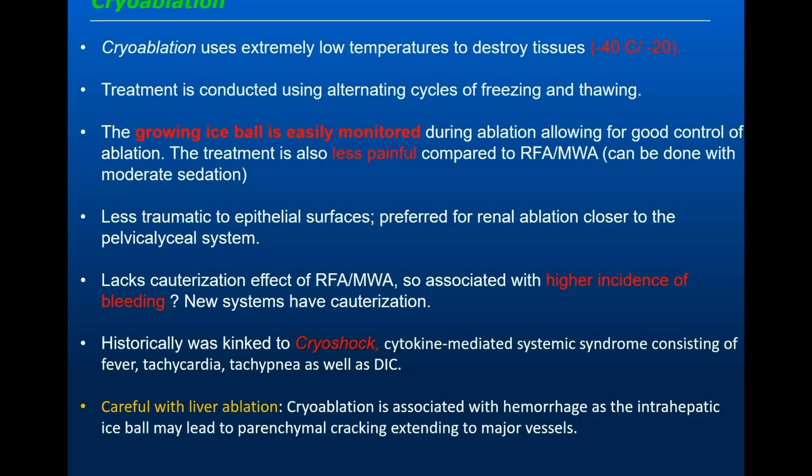You will be surprised that when we are doing cryoablation, we are not only freezing, we are freezing and thawing. This means that we allow the ice ball to form, and then we thaw it. And then we ice form again, and we thaw it. Why are we doing this? I'll just explain in the next slide.